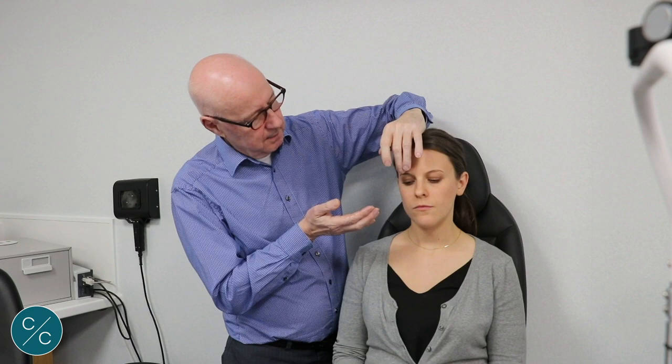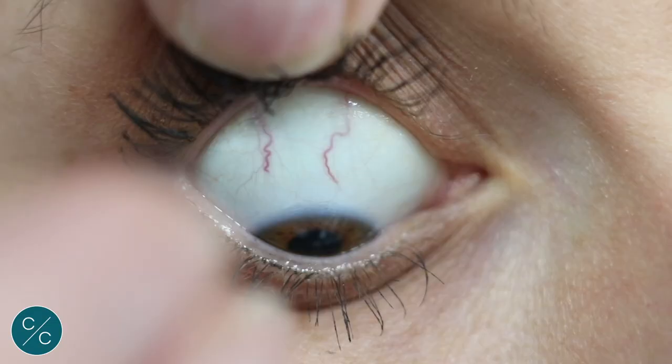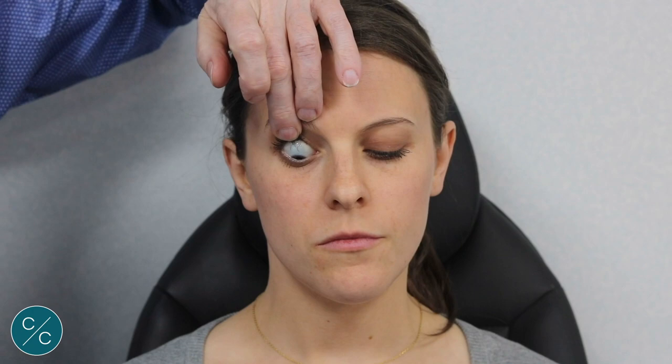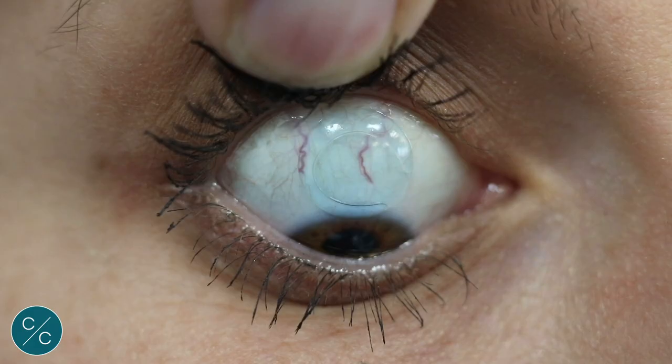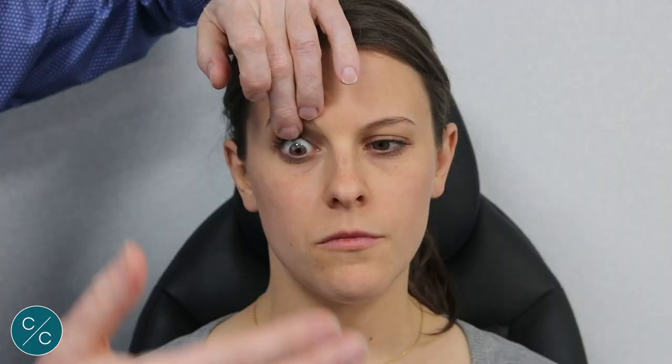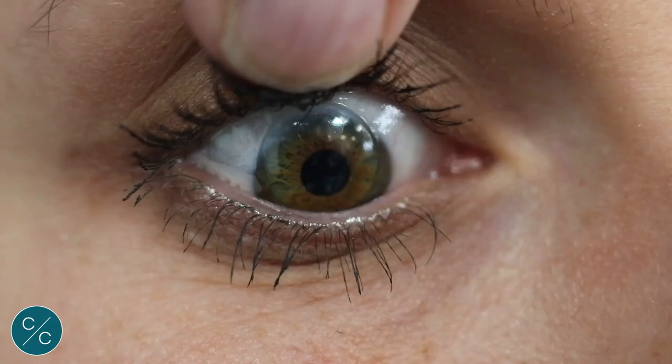The lens is nicely wetted. So if you'd like to look down for me Sophie, I'm going to lift the lid up. You keep looking down. I'm going to place the lens deliberately at 12 o'clock. And if you now look at my hand, I'm going to hold the lens in place with the lid. If you look up and onto the lens, and then look down — I've retained the upper lid so the patient still cannot feel the lens.